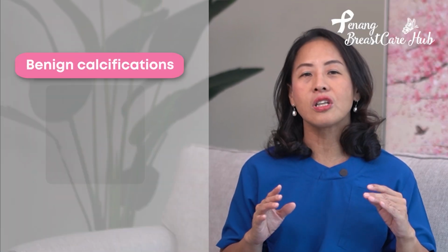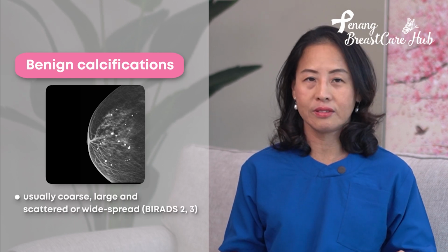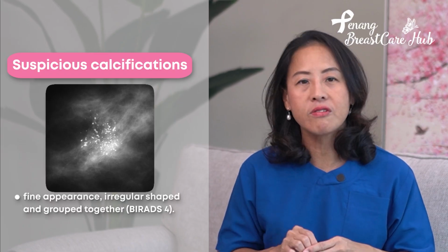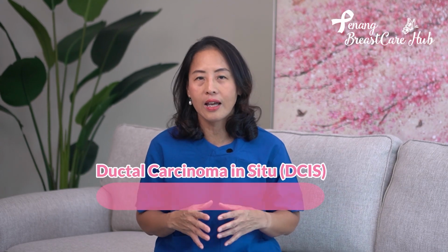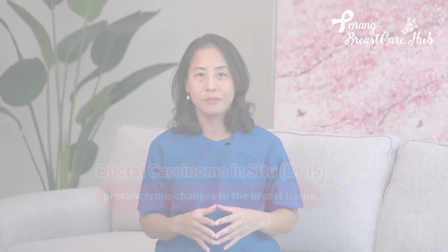Benign calcifications are usually coarse, larger, and scattered or widespread, while suspicious calcifications are fine in appearance, irregular in shape, and clustered or grouped together. These suspicious clustered microcalcifications can be indicative of very early breast cancer called DCIS, which is a precancerous change to the breast tissue.